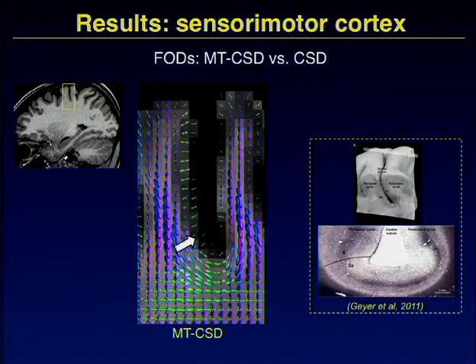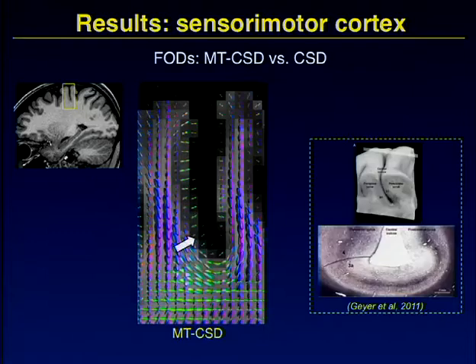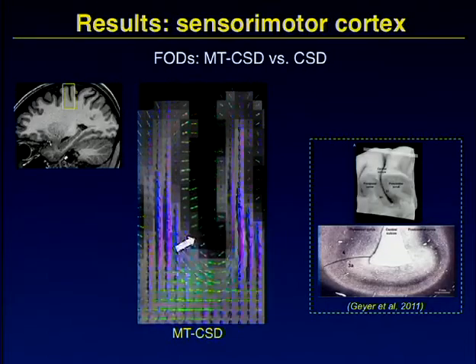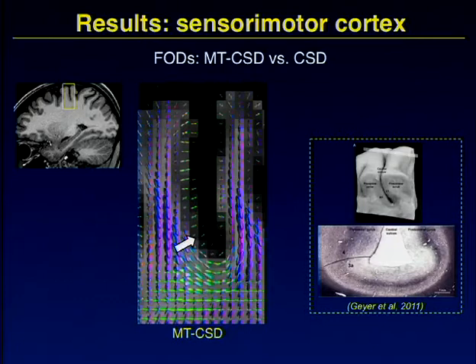And out of interest, again, if you take this data here and now you scale it, just so all of them have the same area under the peak, just to see, I'm going the wrong way, what do you see? There. So these two are exactly the same, but simply scaled up, so they all have the same area. The interesting bit is all these areas that they have very, very little. You see it here. You couldn't see much at all.